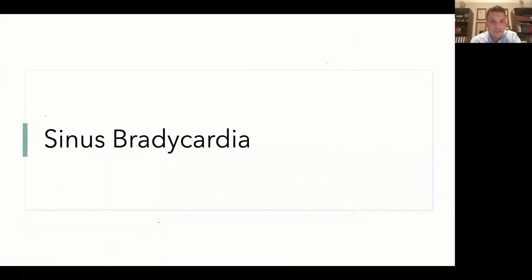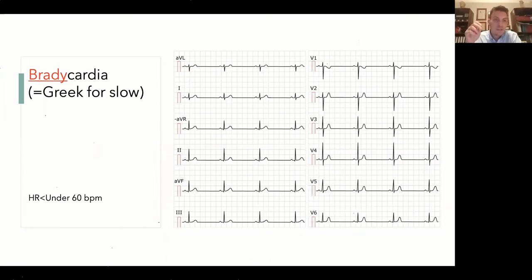Let's go. Sinus bradycardia. We spoke about this, okay? So bradycardia means slow in Greek, bradys means slow, okay? And it will be sinus. So sinus will mean, and I will keep saying this and repeat it again and again until you're familiar with the term sinus, that there is a positive P wave before the QRS in lead 2, which is the principal one that we look at when we look for sinus. And it's present before every QRS wave. So P wave that is positive before QRS and so on and so forth.